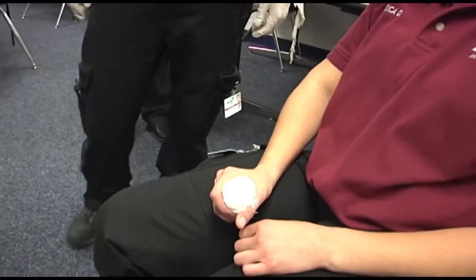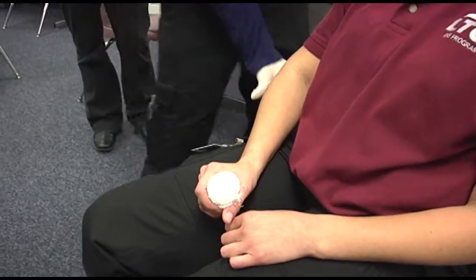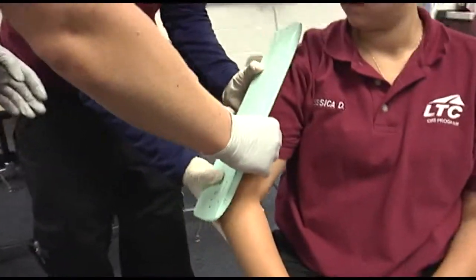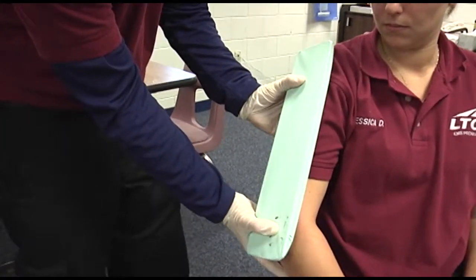We will say it's her right humerus. Go ahead and support the fracture with gentle traction. Check and record the status of circulation, movement, and sensation distal to the fracture site.